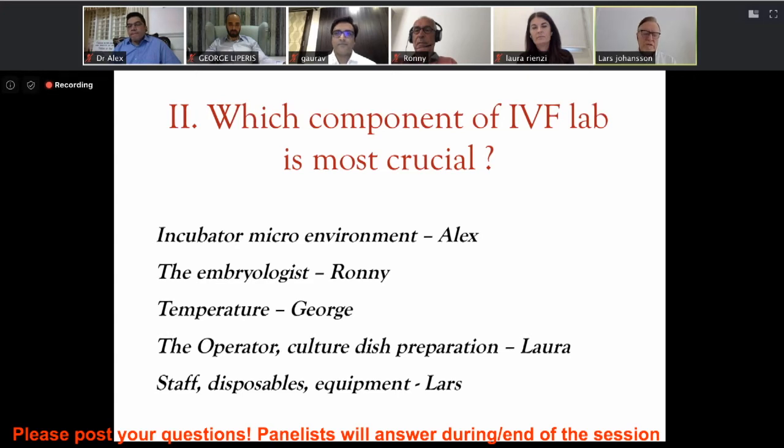when you do culture dishes, for instance, like George was talking about temperature, then if you have the wrong plastics, even if they are embryo tested, they can release a lot of VOCs. And those VOCs are taken up in oil and also the media. And it's actually been shown that they are enriching in the culture medium. So if you do long-term cultures, it doesn't matter if you have an embryoscope if you don't do the drops in a proper way or your handling. There's also the media where you aliquot media.